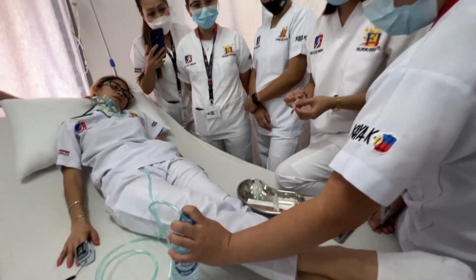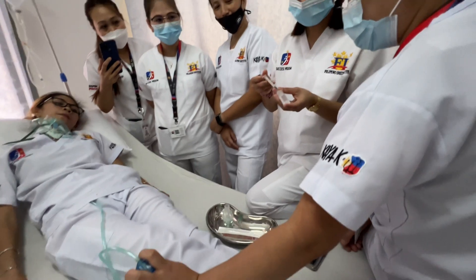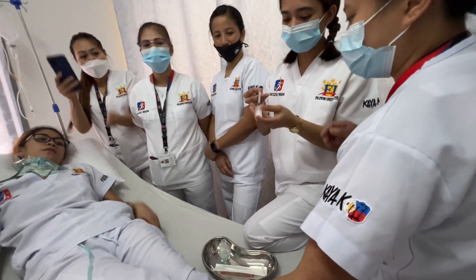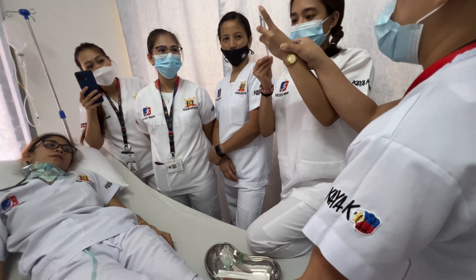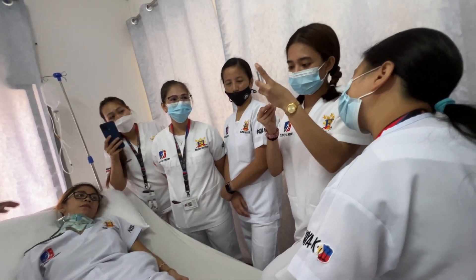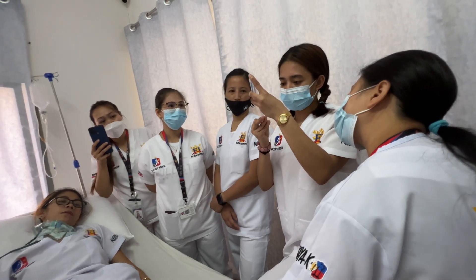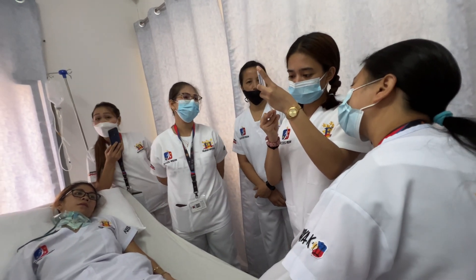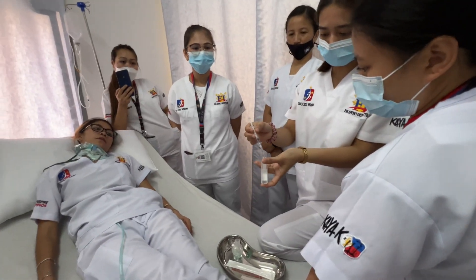How are you going to position to aspirate? That is the proper way — 0.5 — to aspirate any liquids. Even from the ampule, even from the vial, always keep the vial and ampule up. Show me.